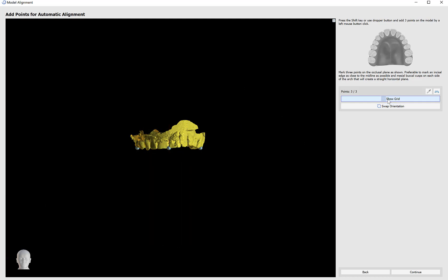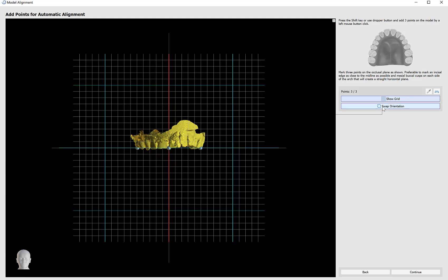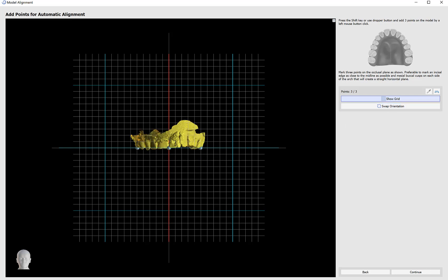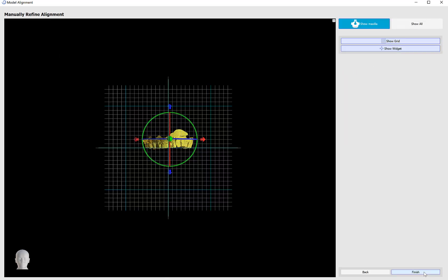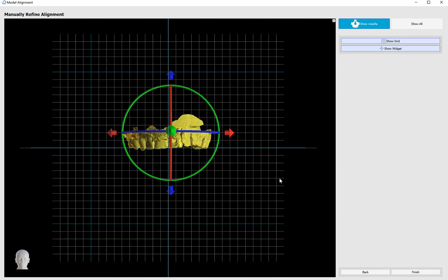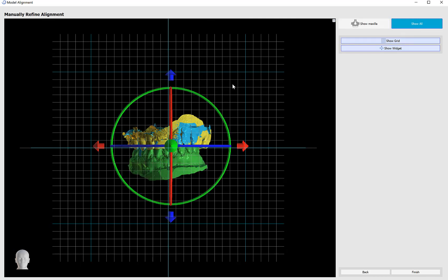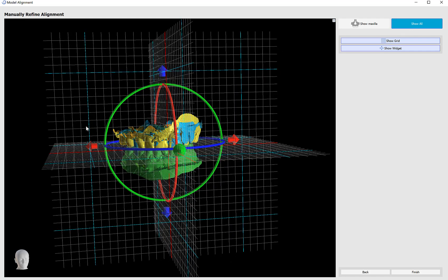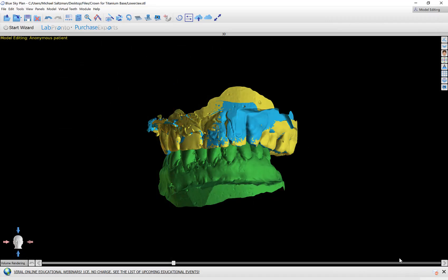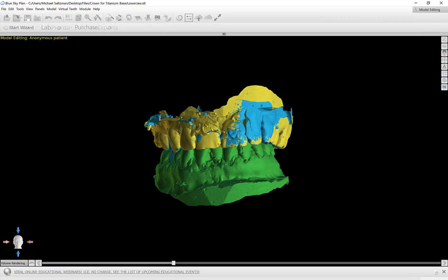I could toggle the grid on and off, swap the model orientation if need be and then click continue. In this step I'm able to fine tune the alignment or the placement of the model by using the widget or grabbing and dragging. I'm also able to toggle on all of my surfaces and then fine tune the placement with the widget or grabbing and dragging of all the models together. The grid and the widget can be toggled on and off. I'm going to click finish to complete the process of importing and aligning the models.